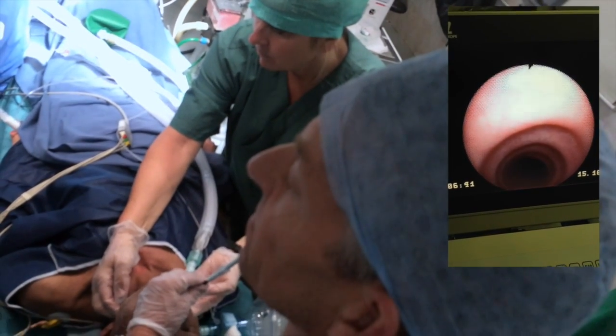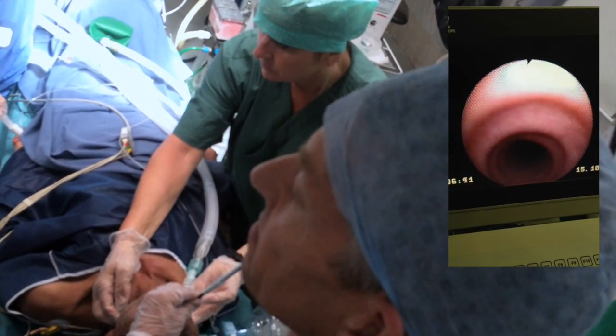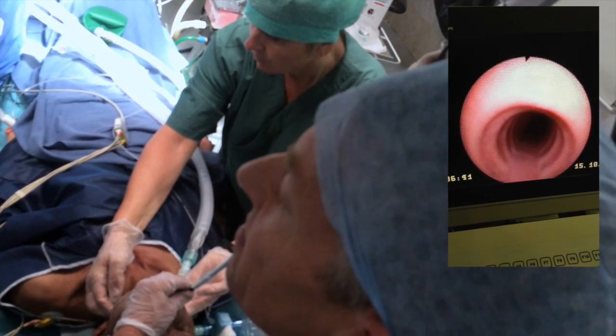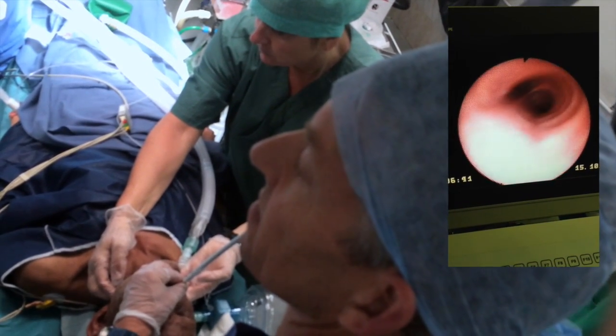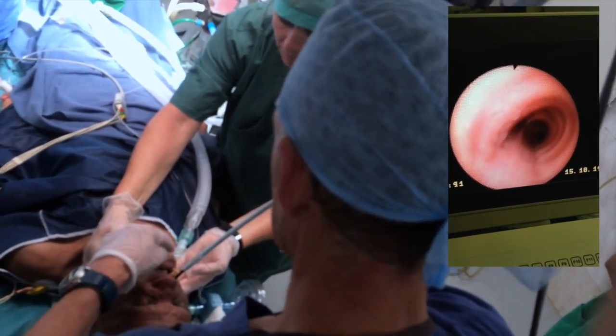You might need a little propofol. I know he's had a load. Have you? Thanks. And the muscularis or trachealis. It's a trachealis muscle, isn't it? Anteriorly? Posteriorly? Yep. So I'm just moving down to the carina now. It's a nice view of the carina there. Okay, now what I need to do, thanks Gru, that's probably okay now.